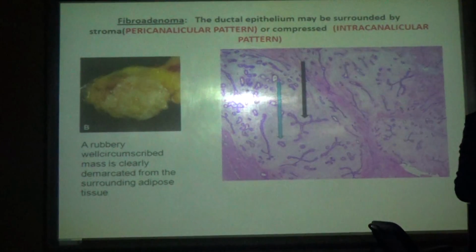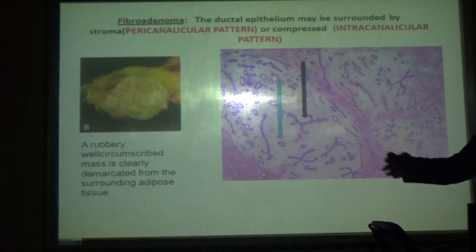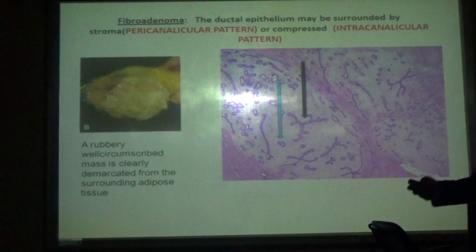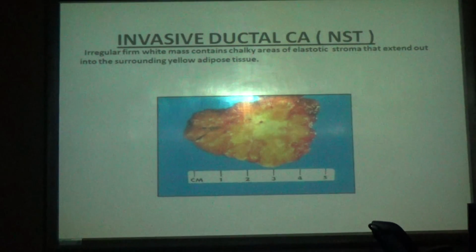Again, fibroadenoma is a benign tumor. You will be reading these pictures again in the breast lectures. This is very classical. Any doubts you have in this? Fine. Next we'll go for the carcinoma.